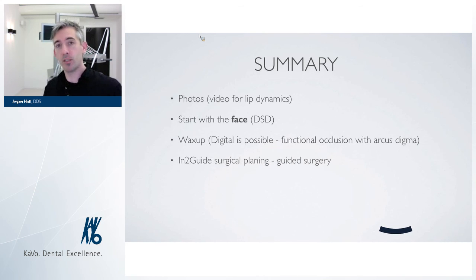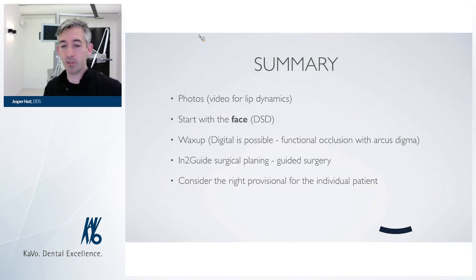The guided surgery is dictated by the WAXUP, which is dictated by facial structures of the patient. Then we consider the right provisional for the individual patient. Is it going to be direct or indirect, immediate loading or delayed loading of the implants?